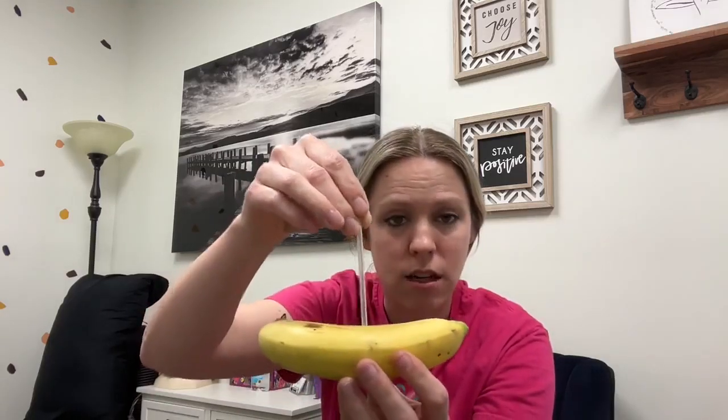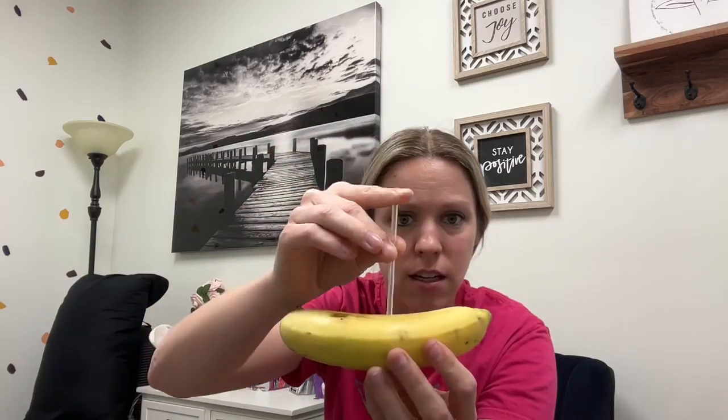A static needling would be where we just go in. Now obviously this banana is not very thick, so I can't push it all the way through. We can just put it in and leave it static. We can just leave it like that, or attach stim to it so they look like little jumper cables.